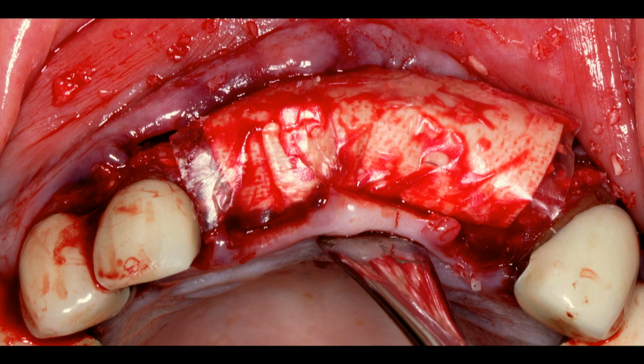I think we have a lot of lip pressure in that area, and things tend to shrink. So I had a collagen membrane that I had over-trimmed. And at that point, I said to myself, well, instead of taking out another collagen membrane and trying to trim it, I just use the large BioXclude and, again, place it over the site dry. I will then go ahead and wet the edges so the edges will suck down over the defect.